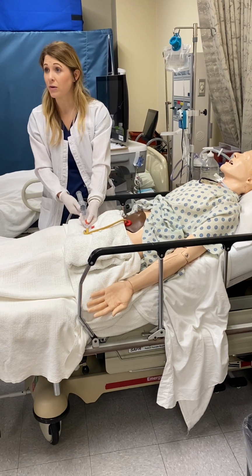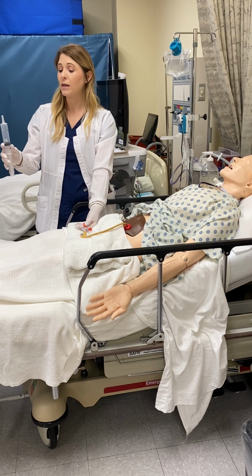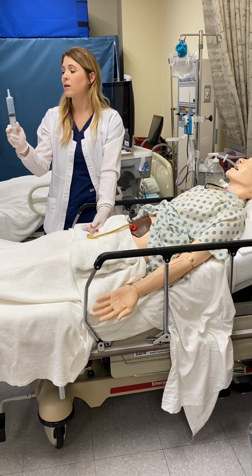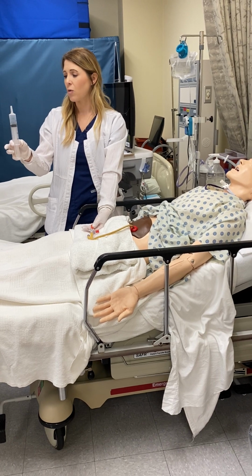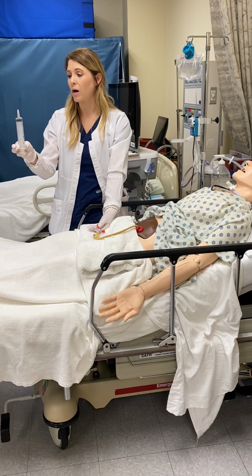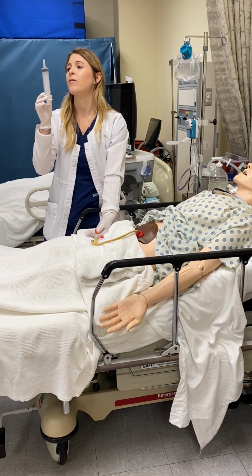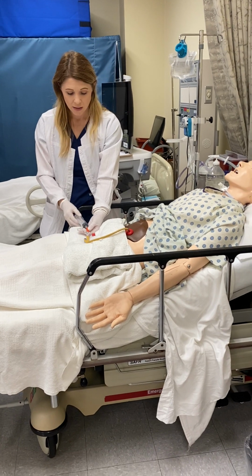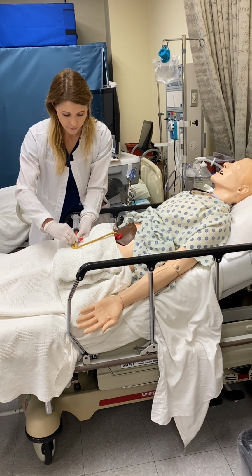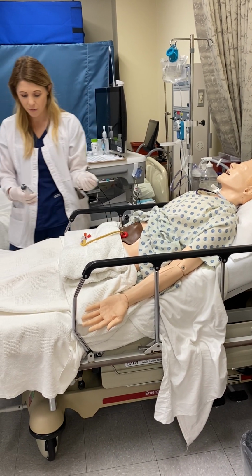If I were to keep getting residual, I would turn it off, take it out, and keep measuring. But the really important thing is you don't want to instill all that air back into their stomach, and you also always have to give residual back to the patient, because if not, you're pulling off vital nutrients, right? So I'm gonna say I have a residual of 2 mLs. I'm gonna give this right back to the patient because that's safe in regards to continuing with my med pass.